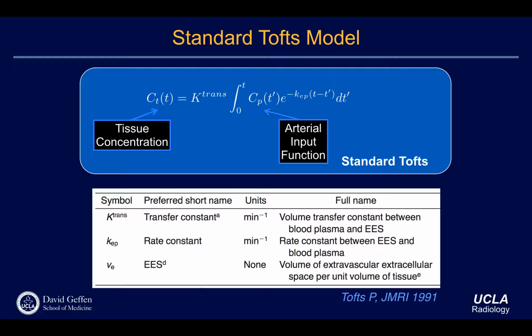Again, as I said, there is an automatic injection, so the rate and dose will be almost identical for all the cases. But does it mean that if you're injecting the same kind of Gaussian shape, it's going to be the same as at a certain tissue location? Right. Then how do we do it?